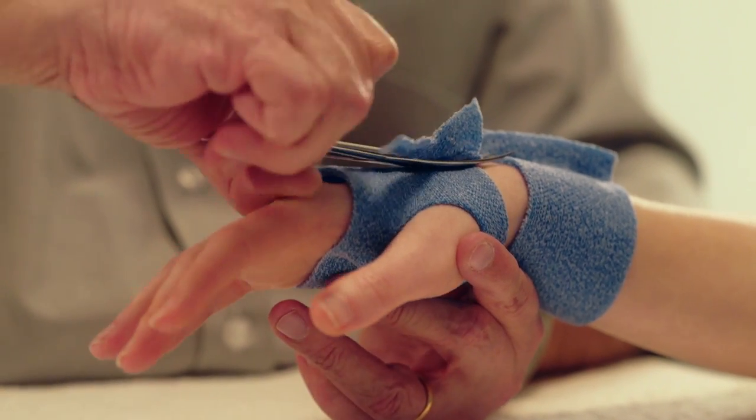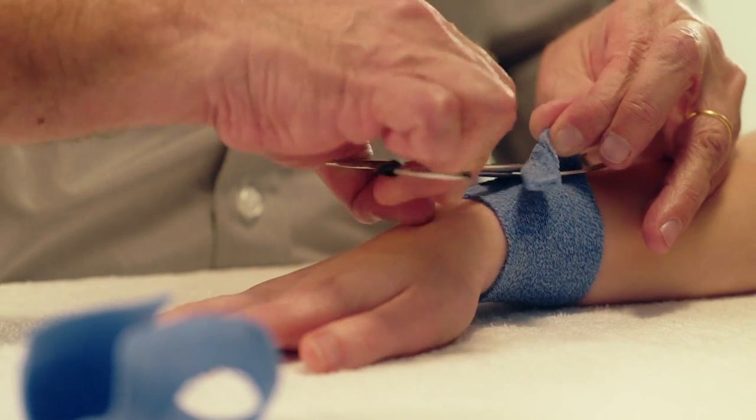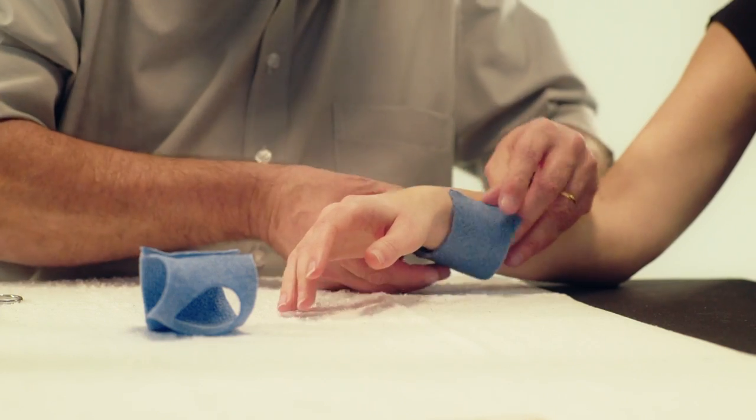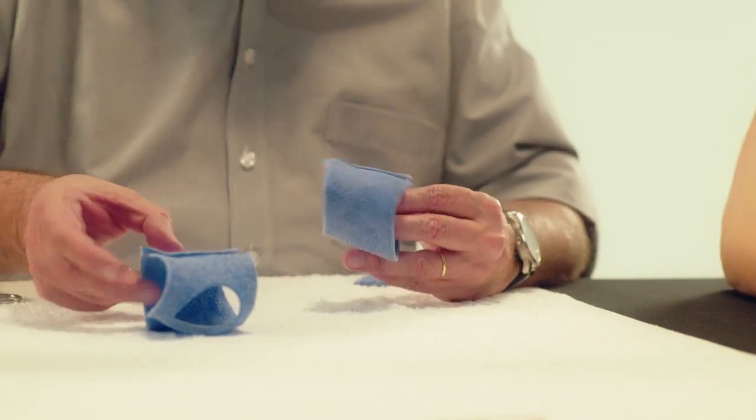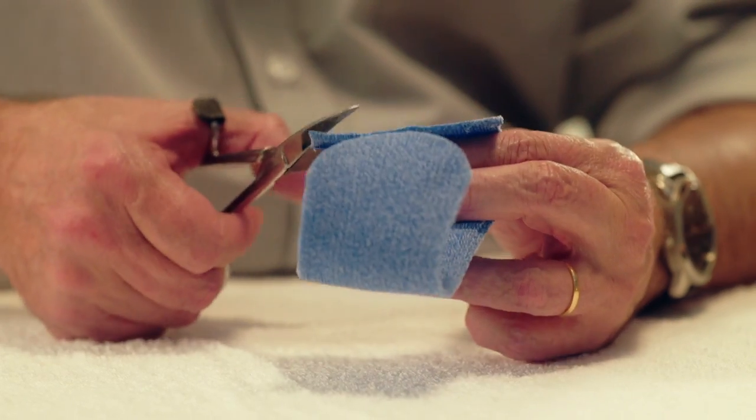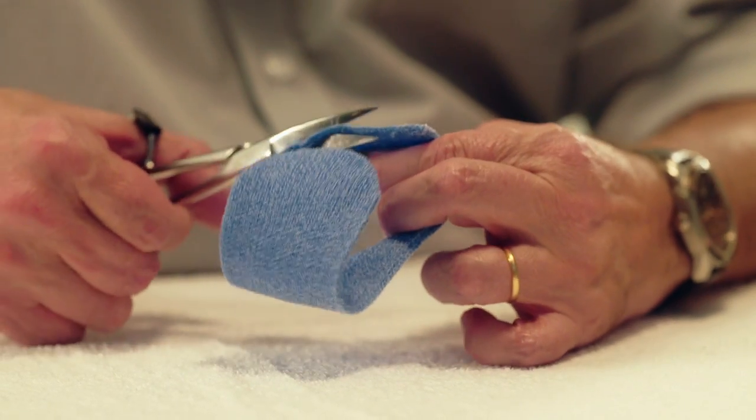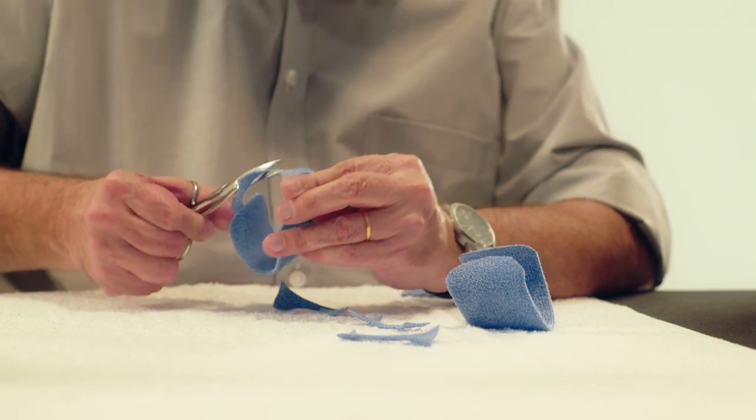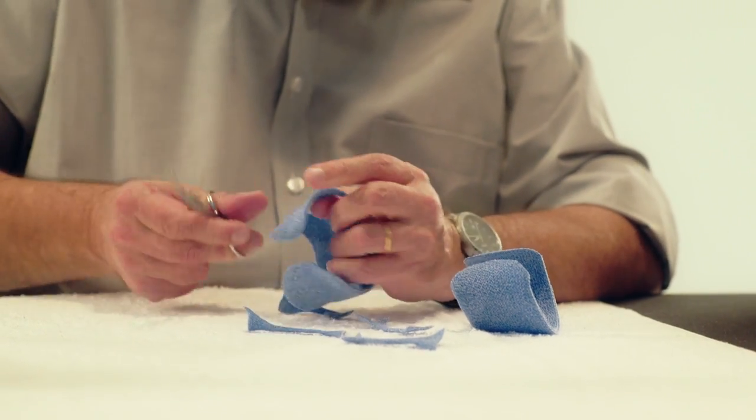Let both pieces harden. Cut away any excess material on both parts, trim the edges and round the corners. Enlarge the hole for the thumb as much as possible.